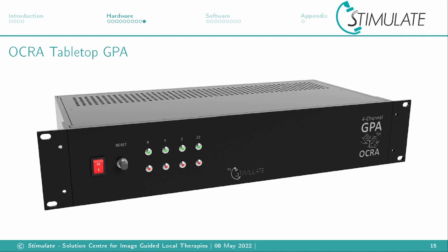Our 4-channel gradient amplifier comes in a 2-unit 19-inch rack housing. It has status LEDs on the front for each channel. Inside there's overcurrent protection to protect the coils and temperature protection to protect the end stage for each channel. This is indicated by the status LEDs. The channels can then be reset via a button.